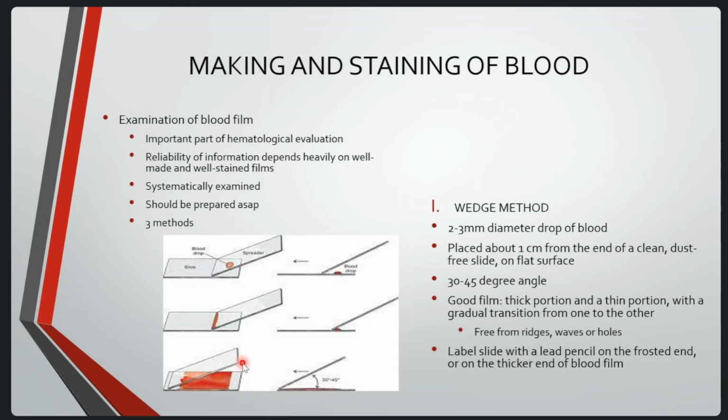We label our slide with a lead pencil if it's a frosted end, or if not frosted, we can also write on the thicker end of the blood film.